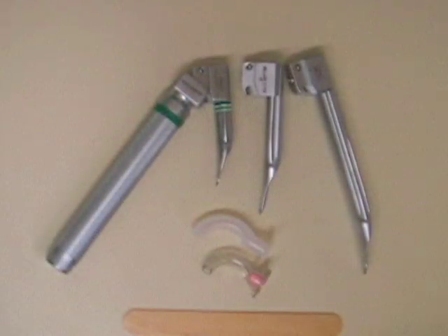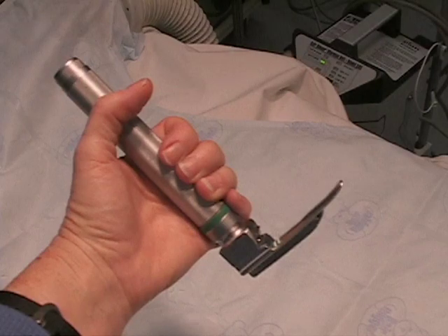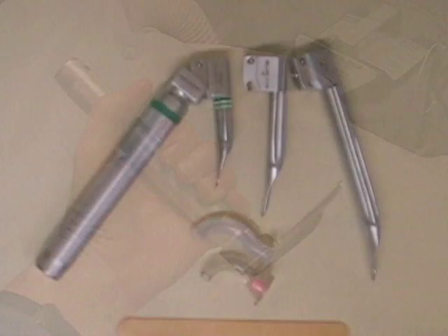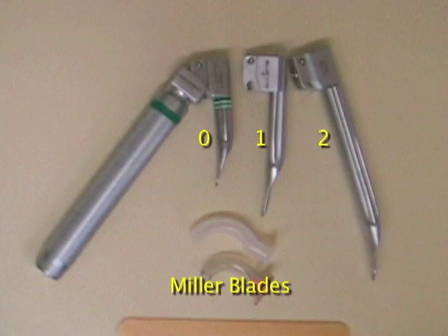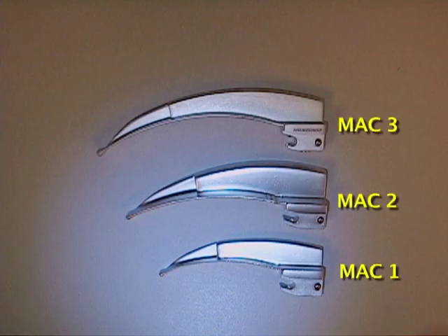We use a laryngoscope to see the larynx during oral intubation, a technique called direct laryngoscopy. A pediatric laryngoscope handle is thinner and lighter, making it easier to manipulate the smaller anatomy. Pediatric intubating equipment should include Miller or straight blades in size 0 for infants, 1 for 1 to 2 years, and size 2 for older children. You may want to have a MAC available as well.